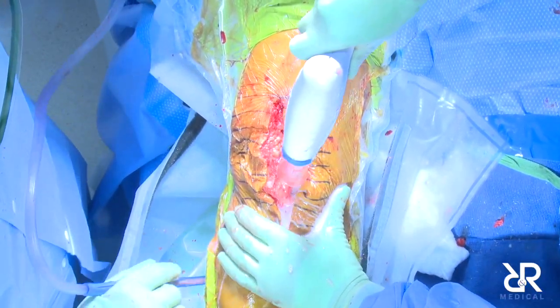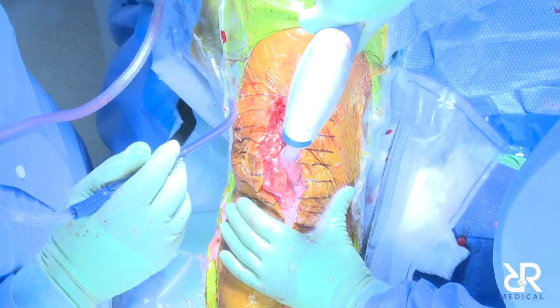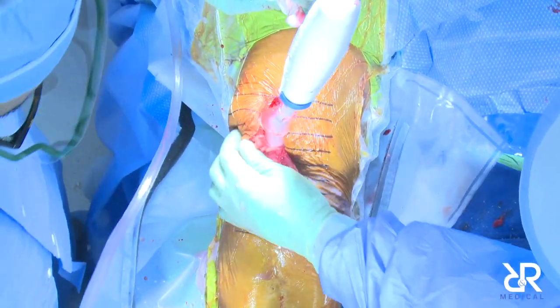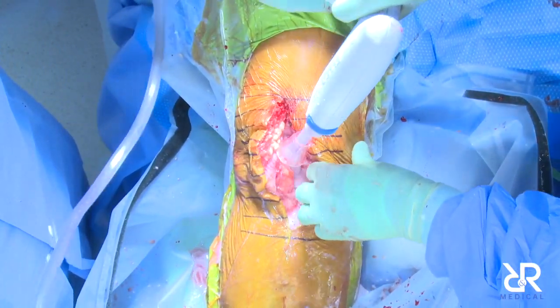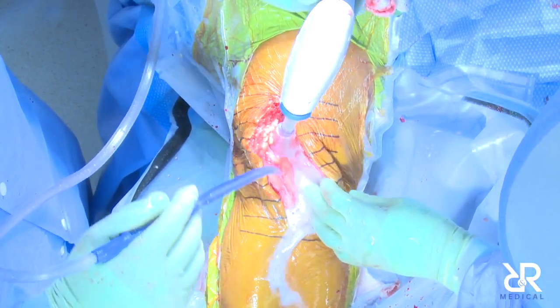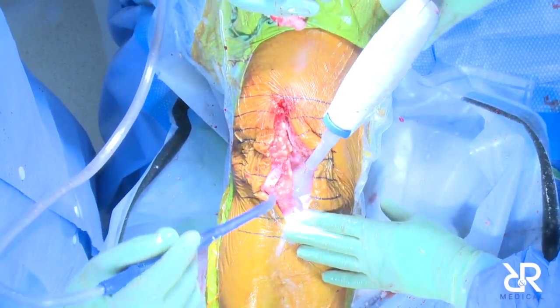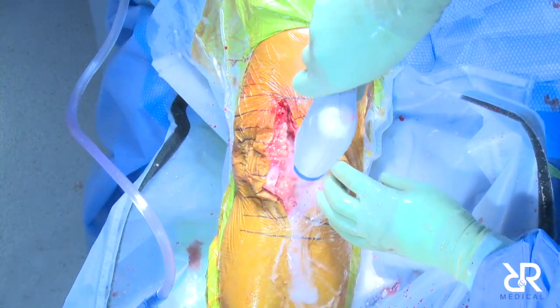Cynthia, you still on? You know what I started doing? I started using non-latex glove for cementing because it doesn't stick to the gloves as much. Small little detail, but it works really well. And the way we figured it out is they opened up the wrong gloves and they work better. Yeah, so we have non-latex and latex glove, and we use only non-latex, obviously, with allergy, because they're more expensive, but, so.